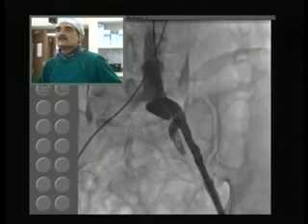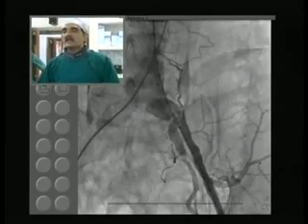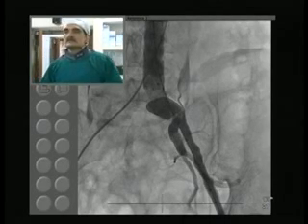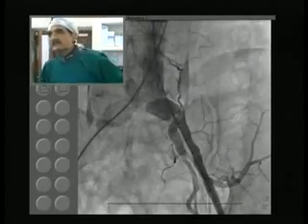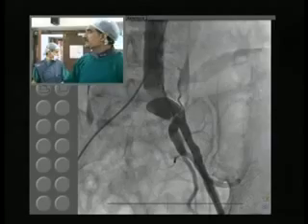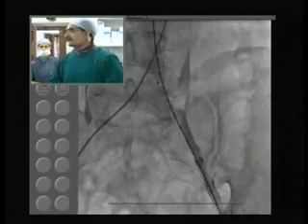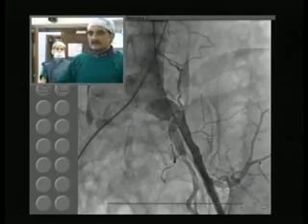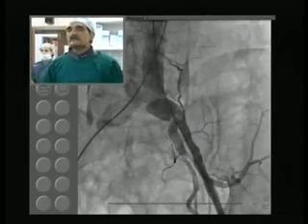Yeah. Okay. That's a little better. We can see the iliac bifurcation now quite well. So we need to end there. So below the device we have to extend by 1, 2, 3, maybe 4 centimeters. So, okay, the 90 device would be better. Okay. All right. So we'll take a 16, 20, 90 millimeter device.